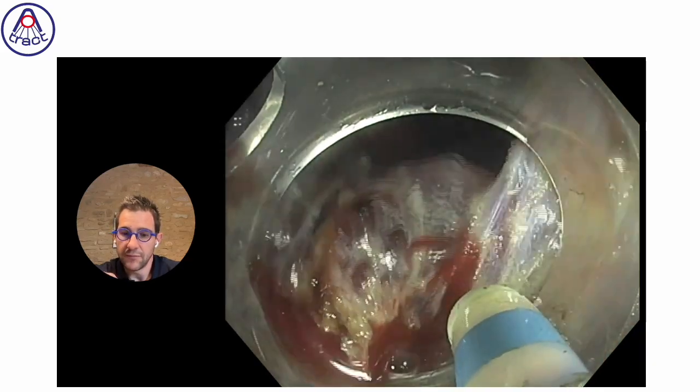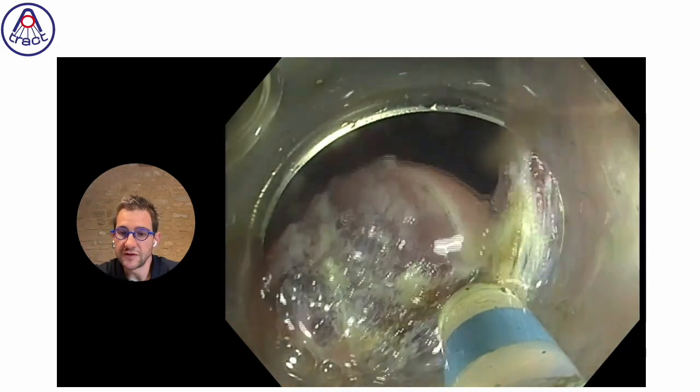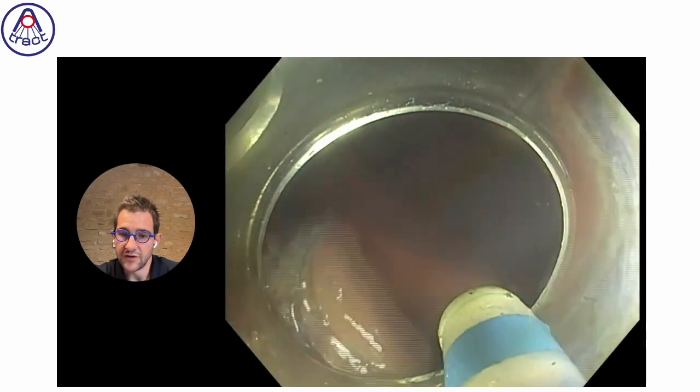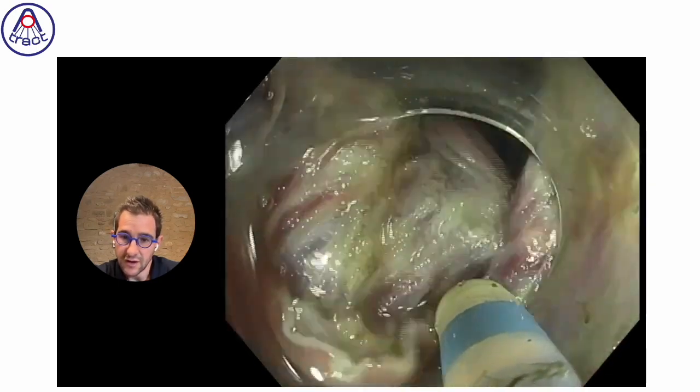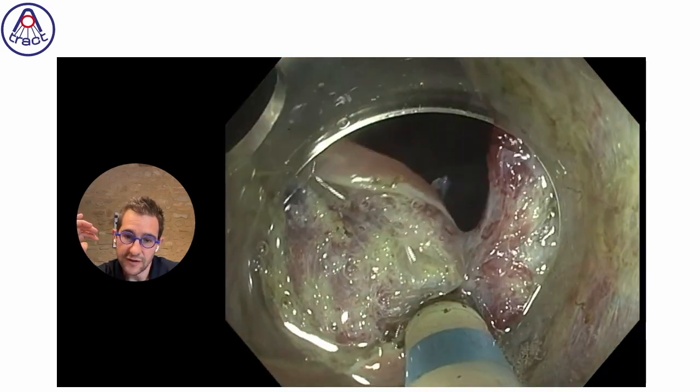So it is also, I think, a force of a strategy which is always the same, that you will always do the same thing. It is a kind of routine procedure. The nurses are used to what you are doing. They are not afraid, and everything is going exactly like you describe it.